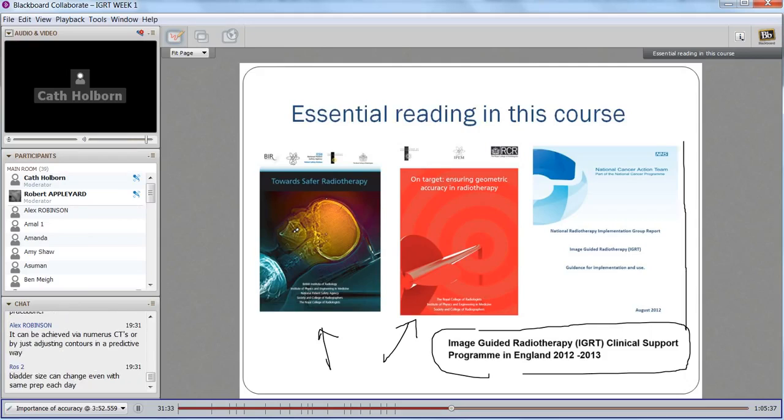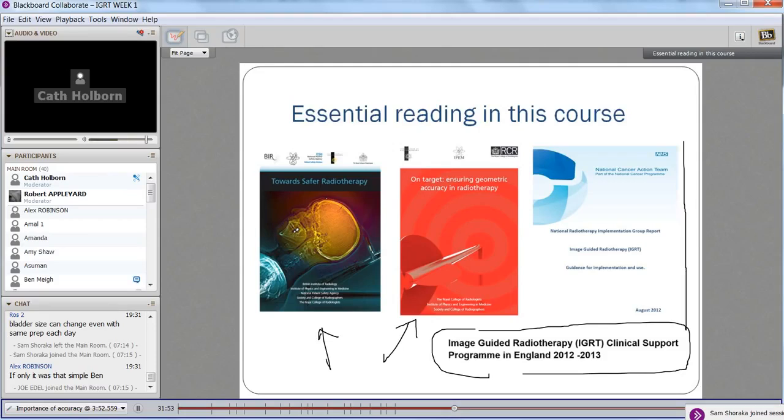I think there's a number of ways in which people are adapting for bladder radiotherapy now, but one of the early methods was this sort of plan of the day. So departments would create several plans at the pre-treatment stage. Usually it just involved different plans with different PTV margins, and the margin would normally differ in the superior direction, because that's where they know there's the greatest amount of movement. And so several plans would be created with different PTV margins at the superior margin.